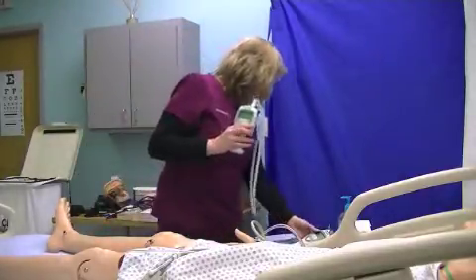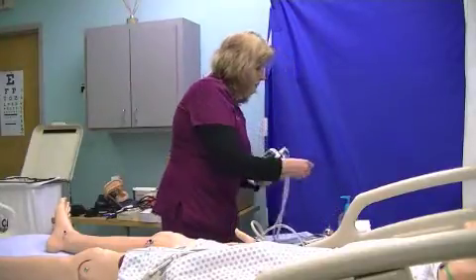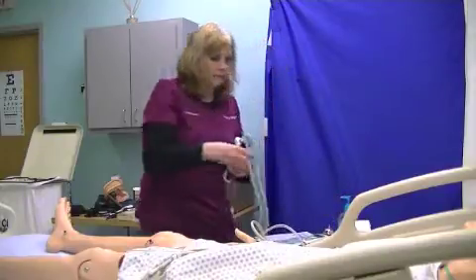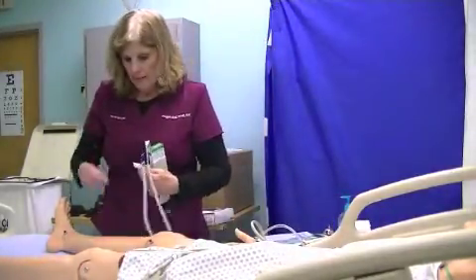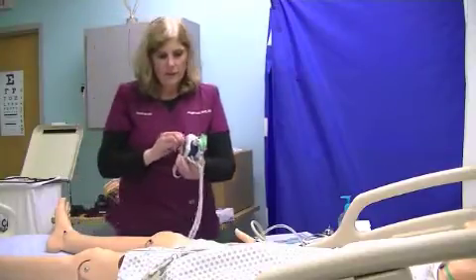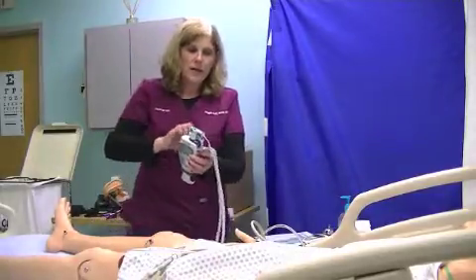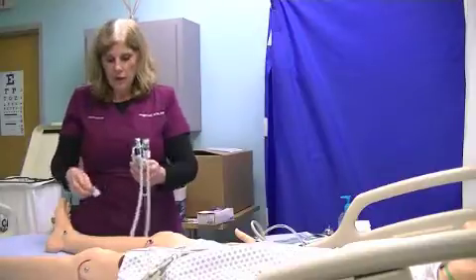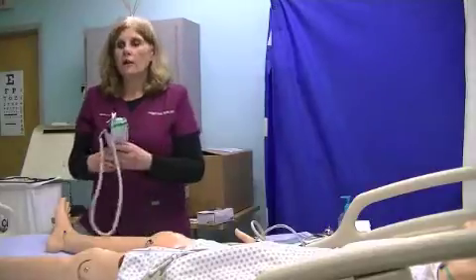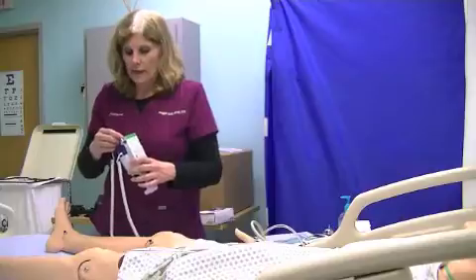Because we're going to do the oral temperature, we want to make sure our thermometer is clean. So we're going to clean it using an alcohol wipe to make sure we get it nice and clean. We don't want to transmit infection back and forth to each person, so when we first start, we're going to clean it when we use it on a patient. If you have a patient that is in isolation, you want to use a disposable thermometer, or take one and leave it in there until they leave, and we do terminal cleaning.